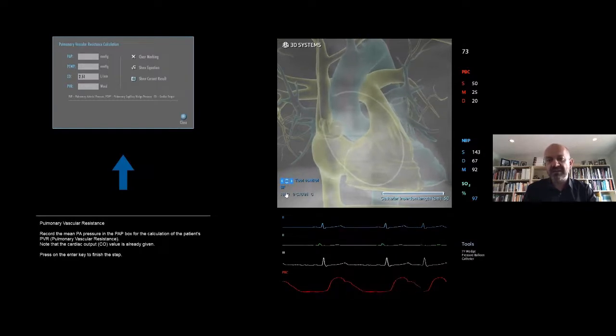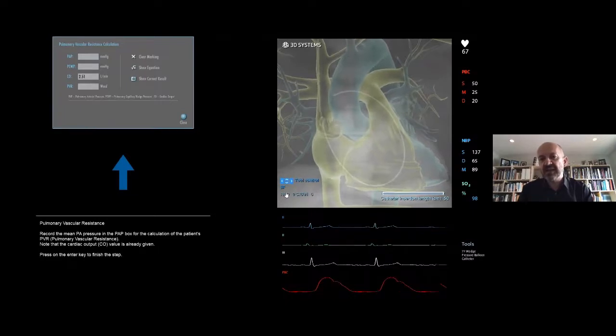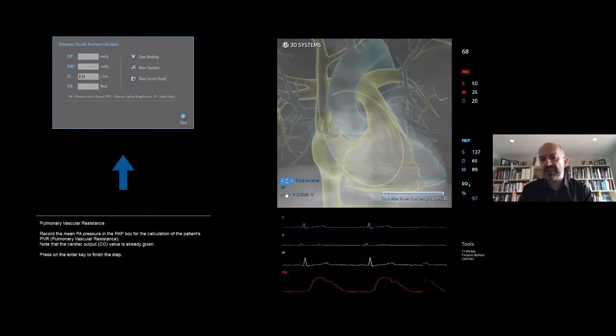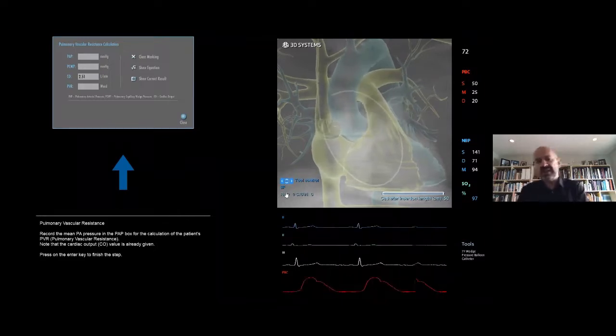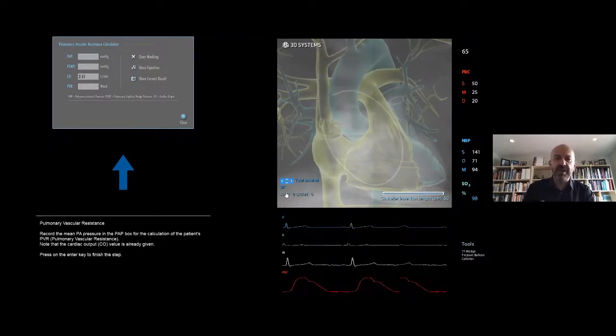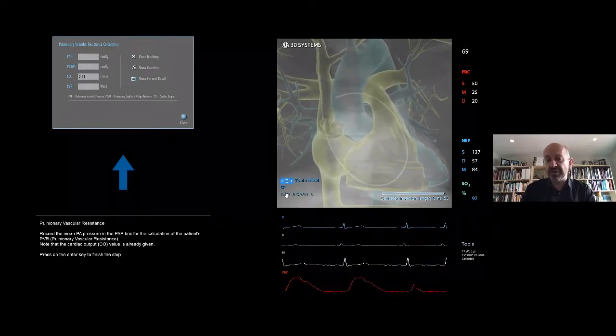So take a look at this. The catheter came from above, right? It came from the SVC, got in the RA, crossed the tricuspid valve, which you see very nicely, then made a big loop through the RV, right ventricle, and then you see how the pulmonary artery is anterior and goes superior, went back up, and then made a turn towards the right pulmonary artery.